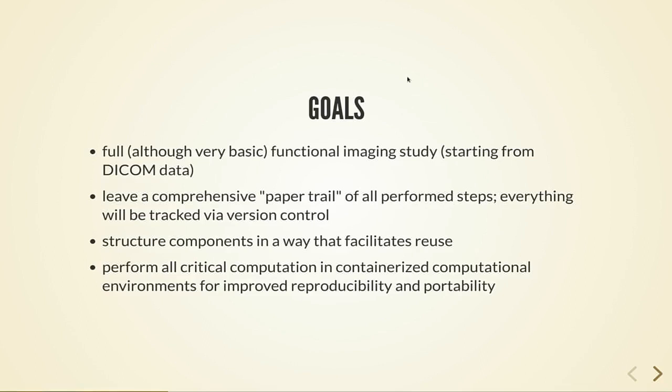We will start from DICOM data that is available on the web for this demo, and by that we'll simulate the situation that we just finished scanning and got the data in the form that you would get it from an MRI scanner. And then we build on top of that starting point all the building blocks necessary. So we'll do conversion into NIfTI format in a BIDS structured data set, as you've seen in part one, and we'll use a container with that DICOM converter to do that. And then we'll take a quick break and get yet another update on how to conduct analysis, and then we'll come back to this exercise and actually do the analysis with a container in a fully reproducible and re-executable way.